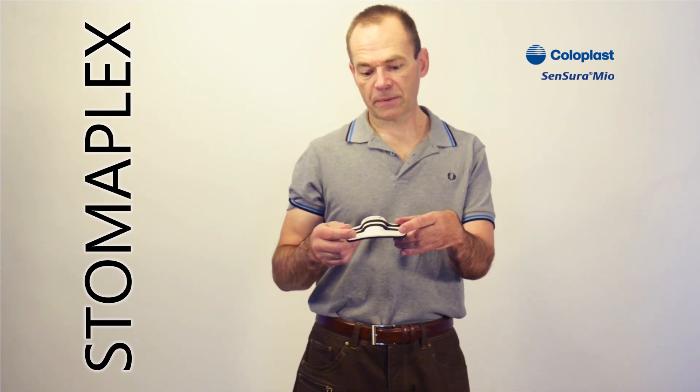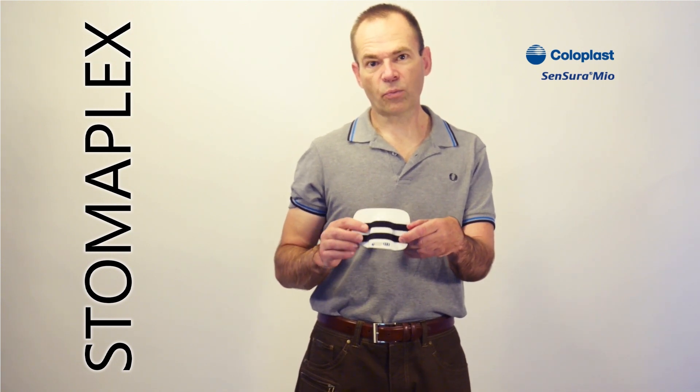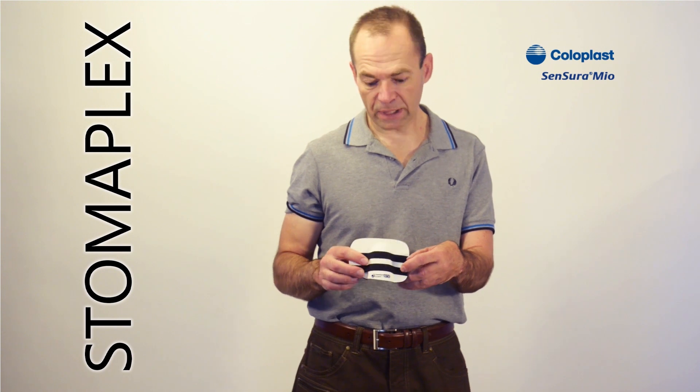Although the guard does come in different depths, this is the three-quarter inch for the stoma clearance. It comes in half-inch, one-inch, all the way up to one and a half inches based on your needs.